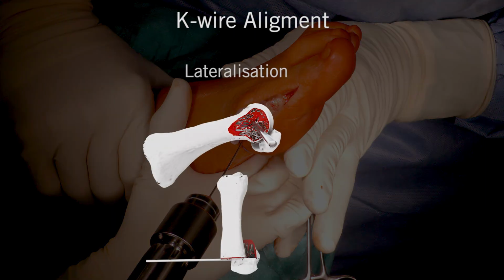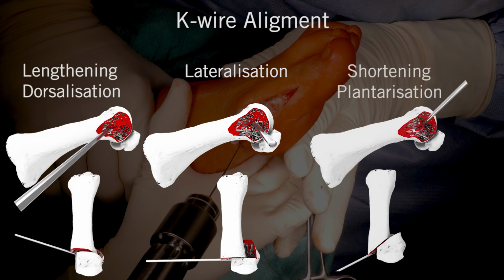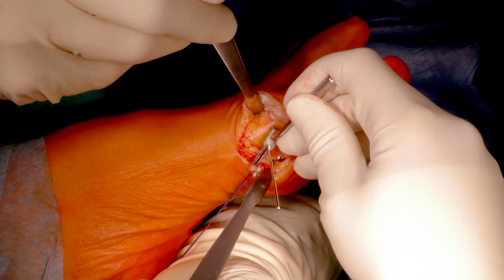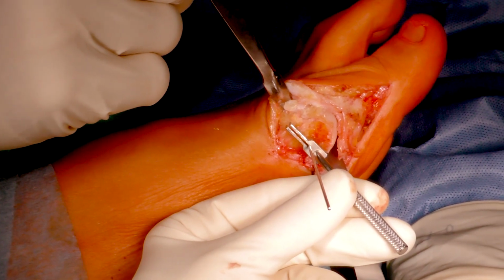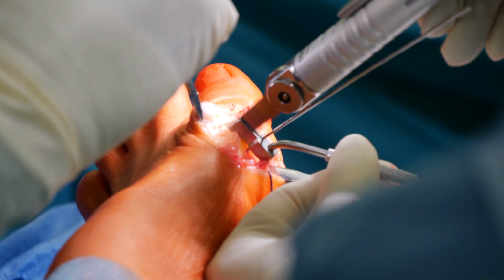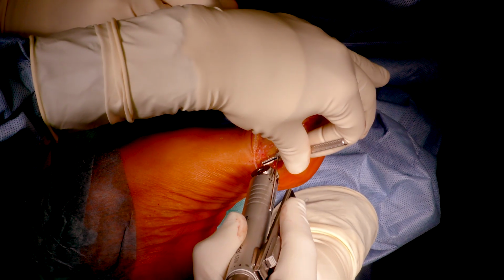By angulation of the K-wire, lateralization, lengthening and dorsalization, as well as shortening and planarization can be achieved. The plantar cut should aim behind the capsule insertion to the metatarsal head, not to damage the arterial blood flow. The dorsal cut should be less than 90 degrees to the plantar cut for intrinsic stability of the osteotomy. The dorsal cut is performed first, followed by the plantar cut.